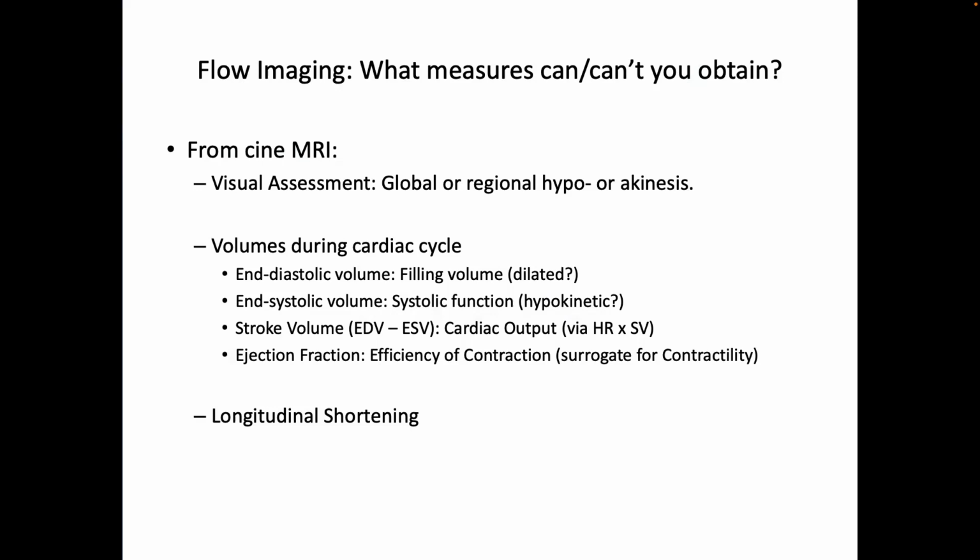Echocardiography has limitations when it's using Doppler, and we saw this on one of the problem sets, is that if you can't get a really good angle, your estimate of flow using Doppler is going to be noisy, right? Because the flow isn't towards the transducer. Whereas in MRI, you basically can get flow in any direction you want. You just select that plane and maybe do your flow encoding perpendicular to that plane.